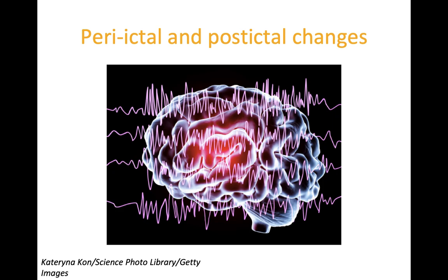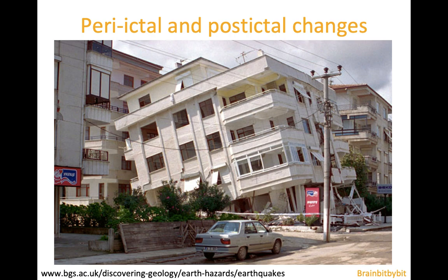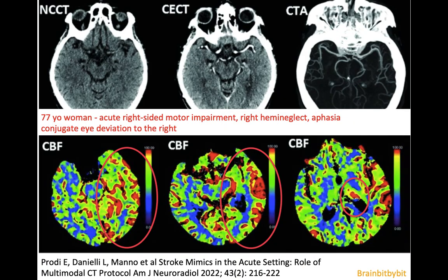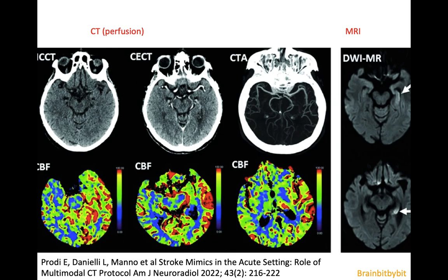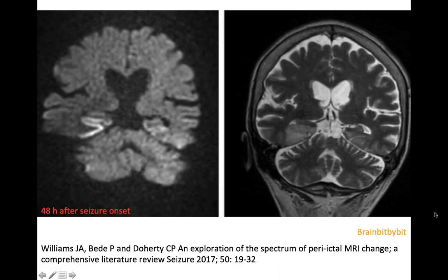I'm going to show peri-ictal and post-ictal changes. A seizure surely shakes things up, and you cannot expect imaging in the post-ictal phase to be normal. We concluded the previous brain bit by bit with a case of a 77-year-old woman with seizures originating from her left hemisphere with hyperperfusion on CT. She also had an MRI in the acute phase demonstrating diffusion abnormalities in her left hippocampus. Edema and diffusion abnormalities is something we often see after a seizure, especially in the hippocampus and mesial temporal lobe.